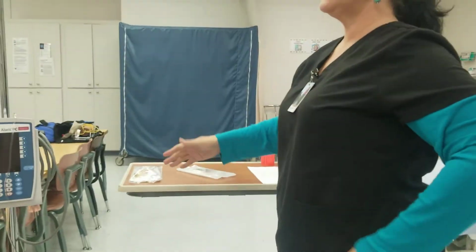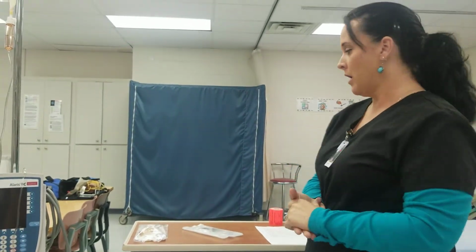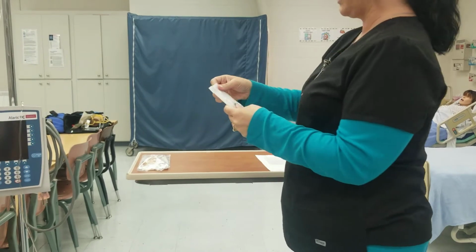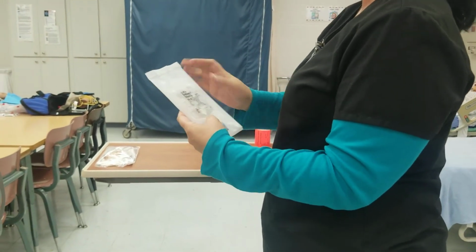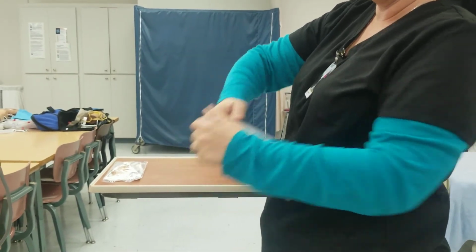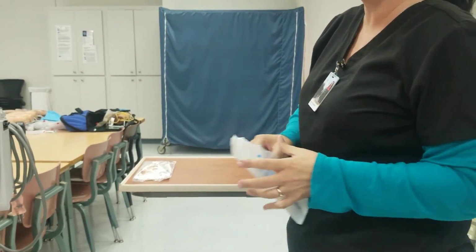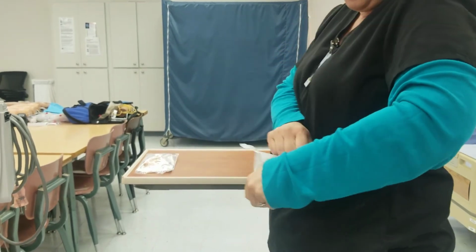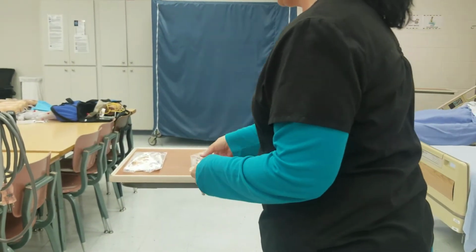Whenever you've got just regular fluids infusing into your patient, say they've got a medication due at 9 o'clock. So this would come down, say, from the pharmacy, and it's already got medication instilled into this bag. So I'm going to go ahead and open it. Remember, I'm looking for clarity, making sure it's not expired, and making sure it's the right medication. So you're doing your rights to medication administration.